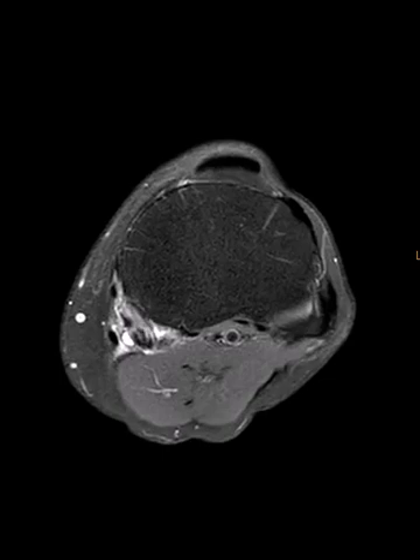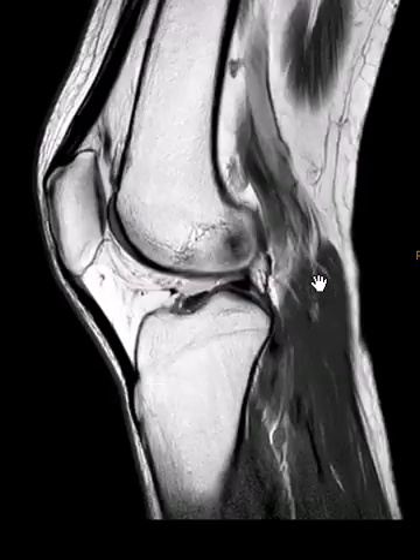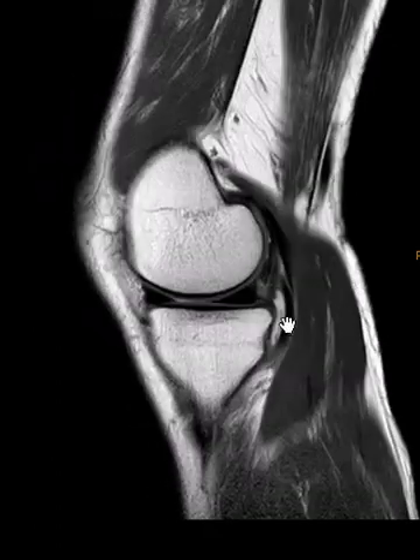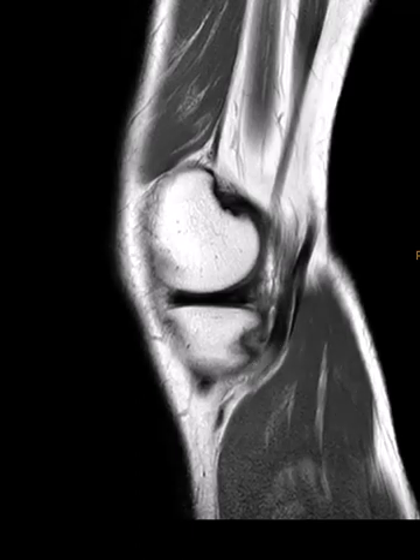Now we put up a sagittal view to try to find this on the sagittal view. So we're going to look on the medial side — this is lateral. When you go medial, we see this fluid collection. This is a PD sequence, so fluid is bright on this. And this is the semimembranosus here. It comes down and we lose it from here to here, so that bright area is the tear. It's retracted back a little bit.